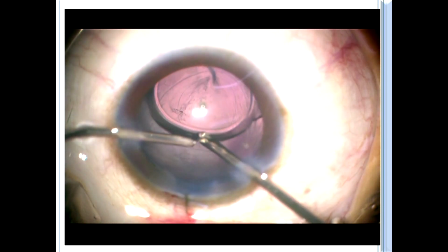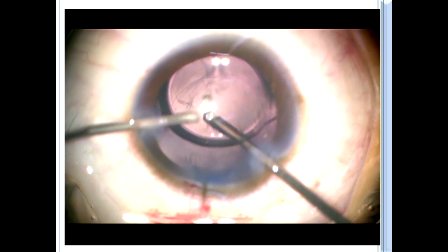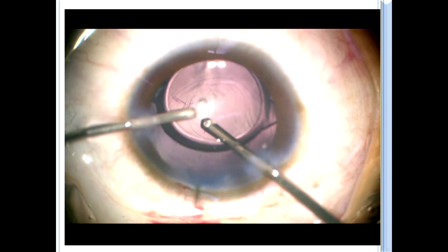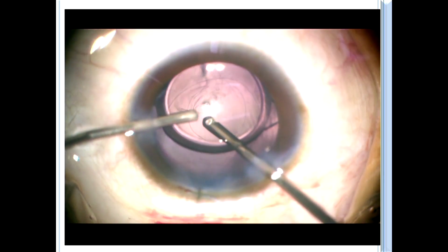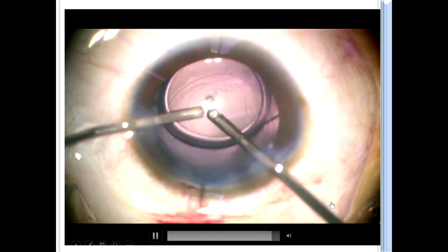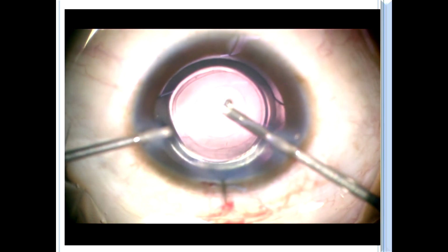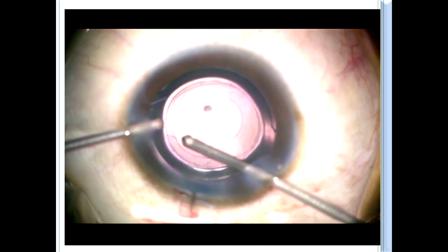And when you are going behind the IOL, you can use the cut IA mode so that you don't cause any traction in the vitreous when you are removing the viscoelastic from behind. Once you have done that, you position the lens back into the bag nicely, and this is how it should look: a nicely overlapping anterior capsular rhexis margin with a central posterior capsular rhexis.